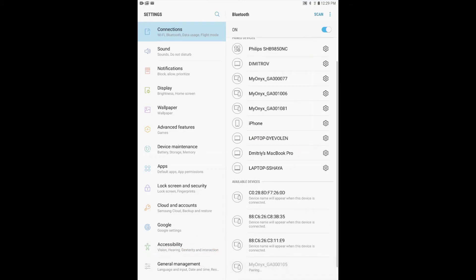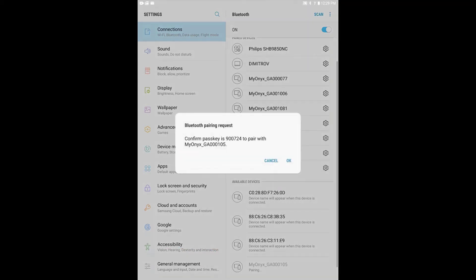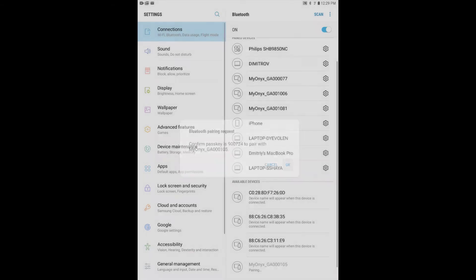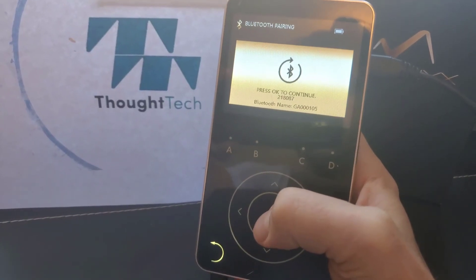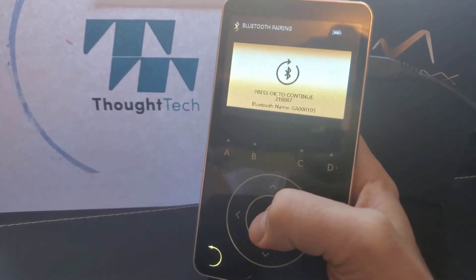Click OK to confirm the password and then click the OK button on the Myonix device as well to finish pairing.